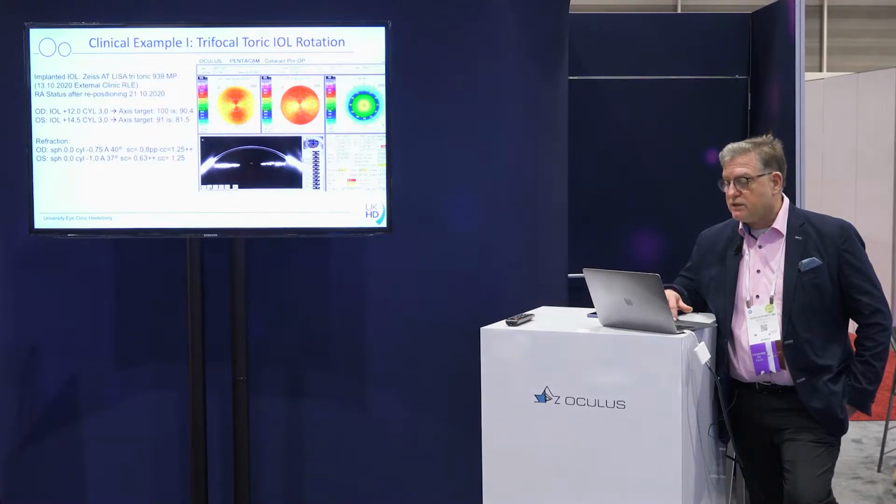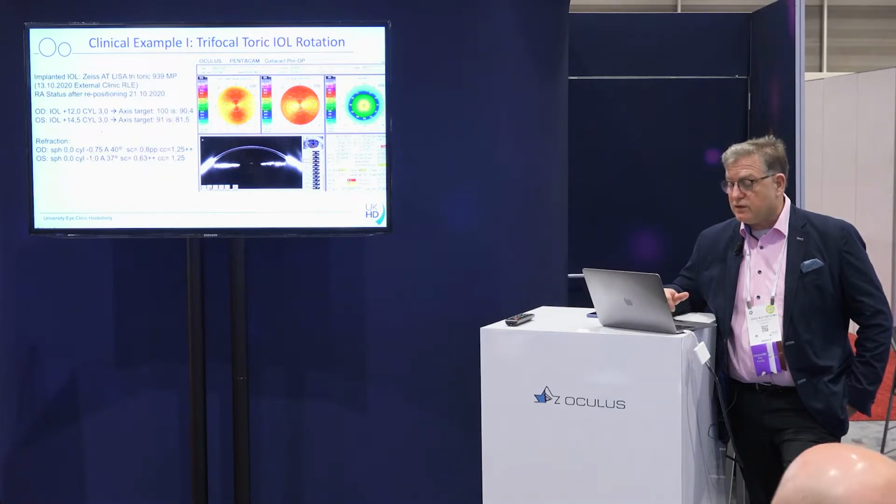Here we have a patient who got surgery somewhere else, and he got a trifocal toric lens implanted. You can see it's a higher myopic patient, and the target axis was 100 degrees for the right and 91 for the left eye, and you already see here that there's something wrong. But let's first look at all the data. We can see that the patient has a residual astigmatism, even though he got a toric lens.